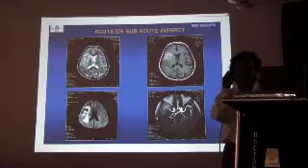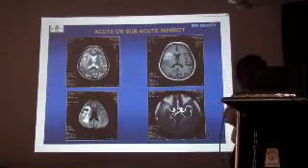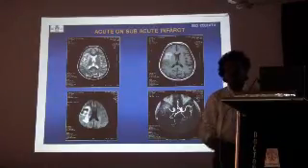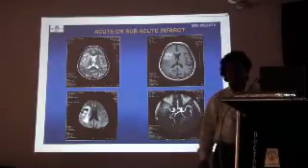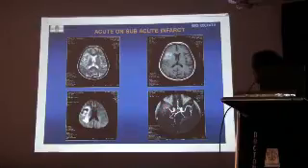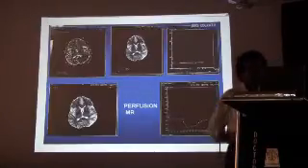We need to know if you want to treat the patient immediately. Say you are going to send the patient for thrombolysis, either intra-arterial or through the catheter into the particular artery. Then you need diffusion. But here already we have some long duration. Okay.